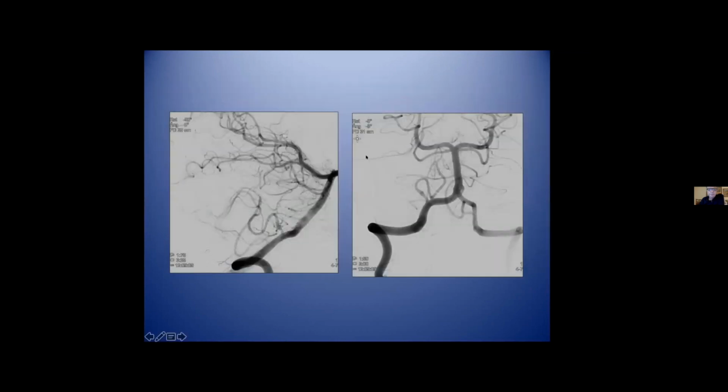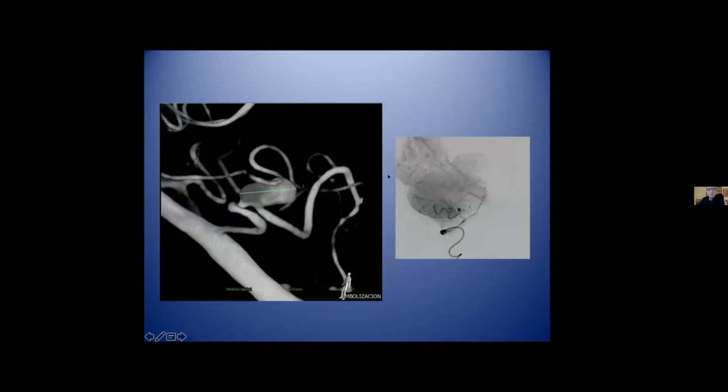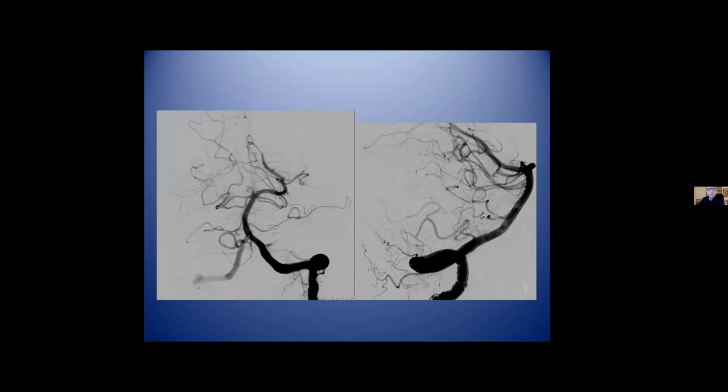But before after. In another situation, it's most easy testing. It's possible to occlude the vessel because many times you have the collateral circulation. This is the reason when in this patient I treated by occlusion the aneurysm and the parent vessel PICA without symptom.